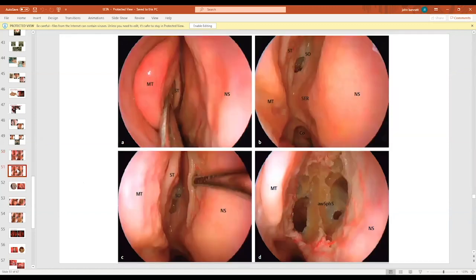Once you are here, look at picture C. It just shows you how you make your incision. You are free, if you want, to make the nasal septal flap as I described previously, or you can just make a vertical incision, up to down, and then move the mucosa laterally. You do this posteriorly, and when you finish mobilizing laterally, it will show you the ostium. From your ipsilateral ostium, you move a little bit laterally, about 1 centimeter, to get to the contralateral ostium. From there, you do your posterior septectomy, and then you're inside your sphenoid sinus.